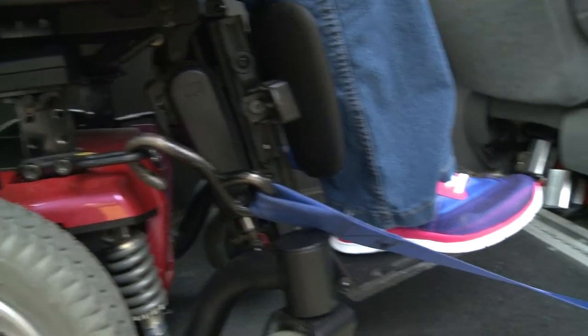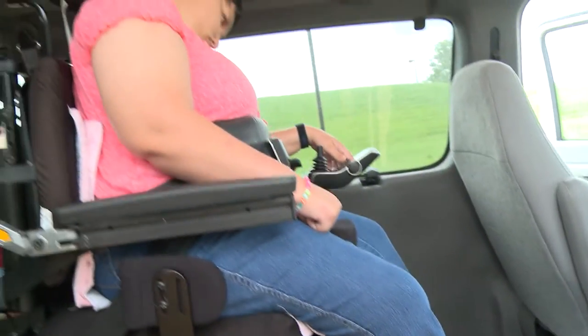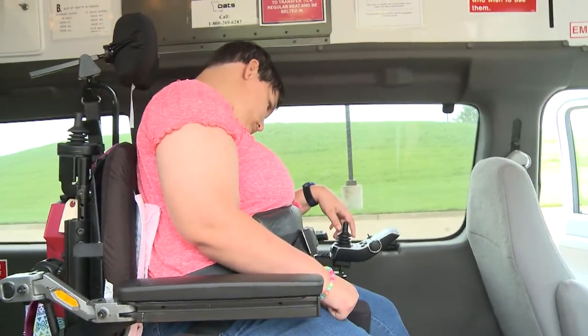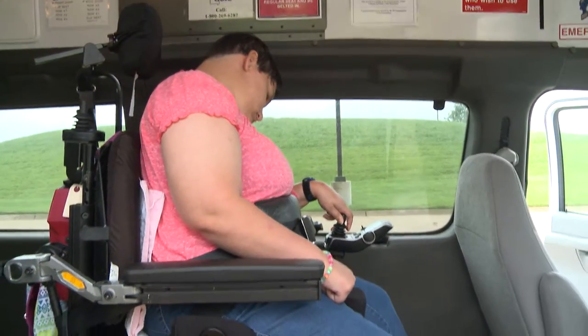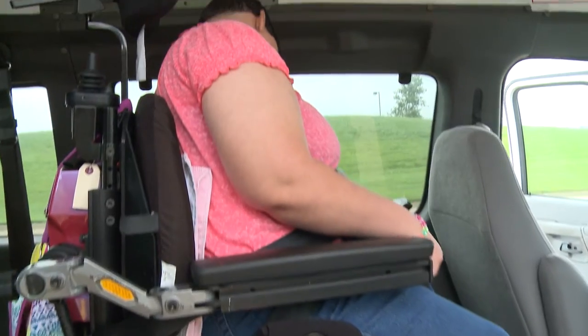Okay Ashley, you want to drive forward for me about six inches or so? I'll let the retractors draw up the slack. That's good right there — stop. Thank you. Now turn your power off for me.